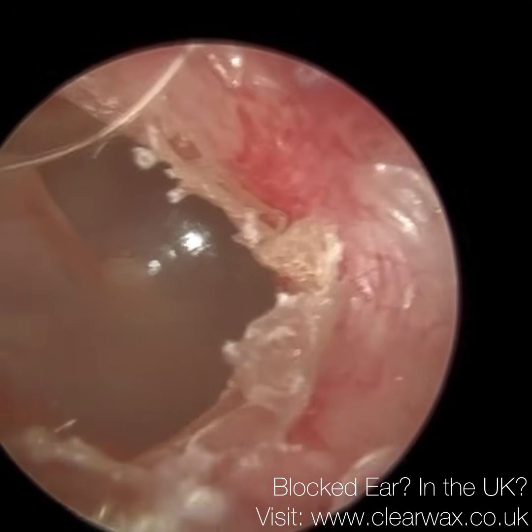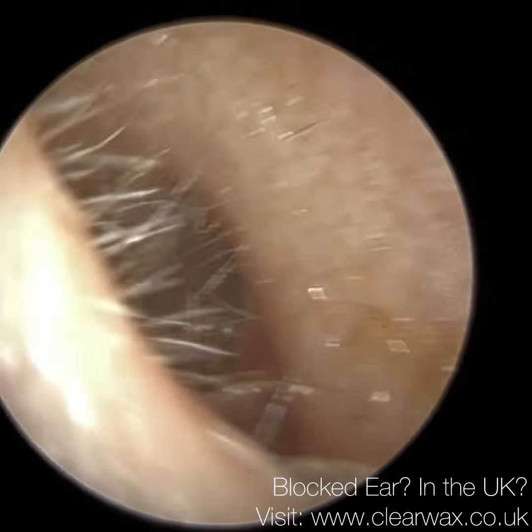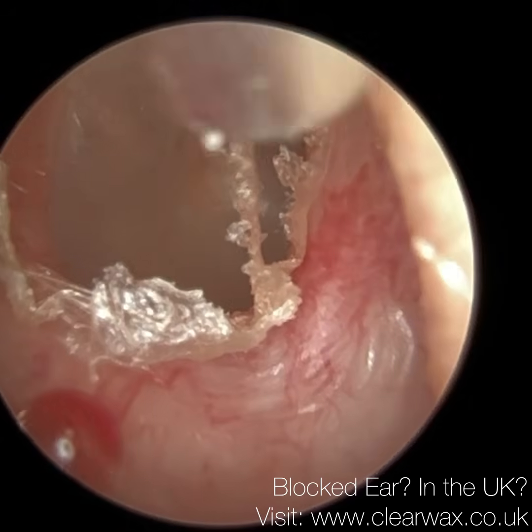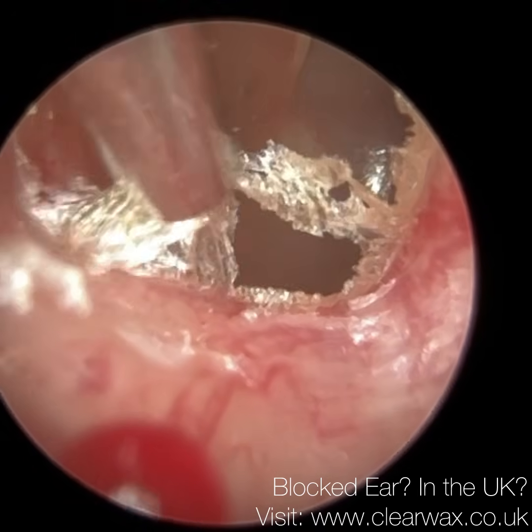But there's that widening again, and there's a little blood blister there, a bit of granulation tissue bottom left, and also right on the floor. So we're just going to spend a bit of time peeling some of the skin. The skin was really, really difficult. So there's that. That's that border where I am now, where the skin is.